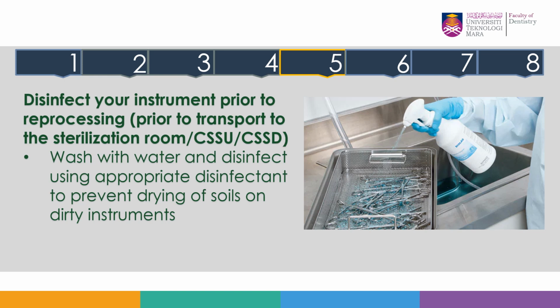You need to wash your instrument first with running water, and then you can use the appropriate disinfectant to spray the instruments. So this is just to prevent drying of soils on the dirty instruments, so in the sterilization room, they wouldn't have any difficulty removing the debris.